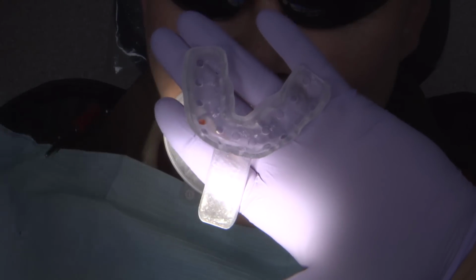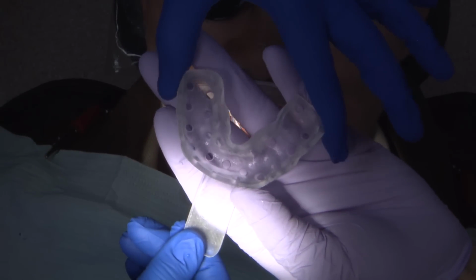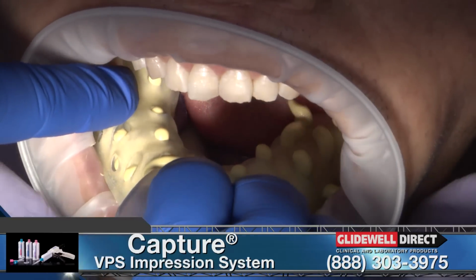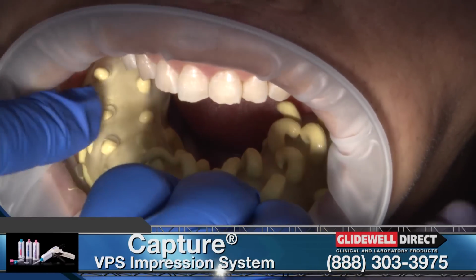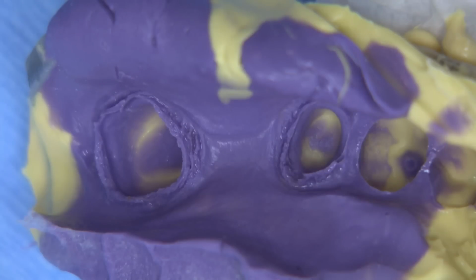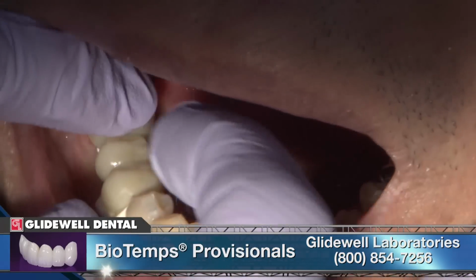I will use a custom tray, and for this case, I asked the lab to give me a full arch digitally designed custom tray. It is rigid and has retention holes, so I confidently use capture impression material without the need for adhesive application. You can see here the BioTemps bridge being cemented in place.